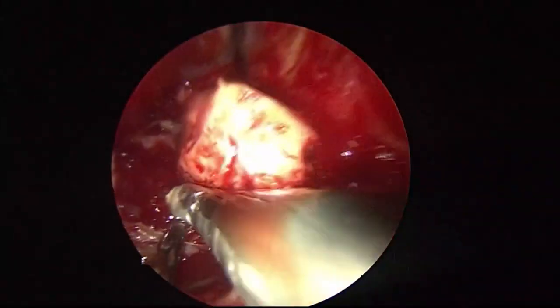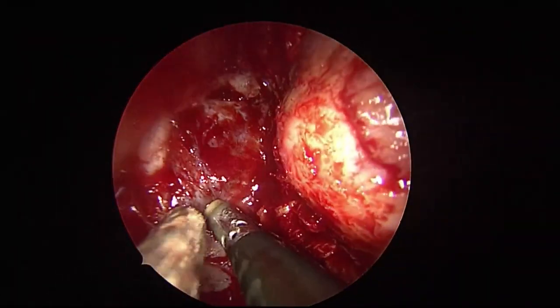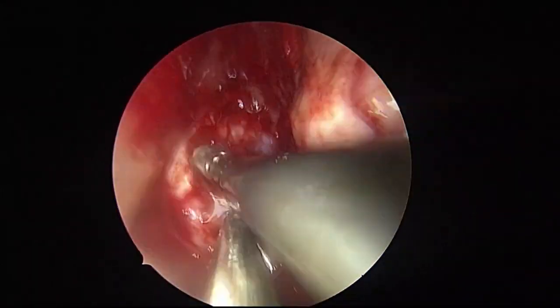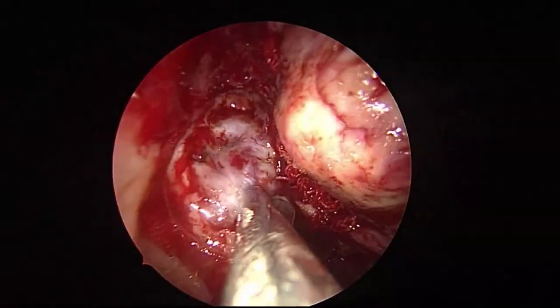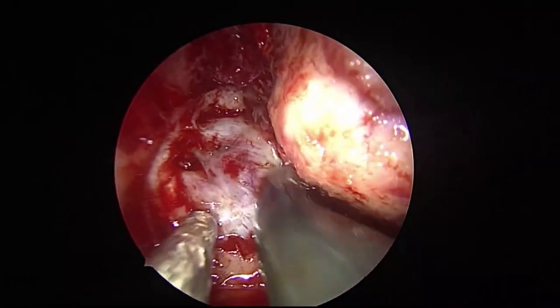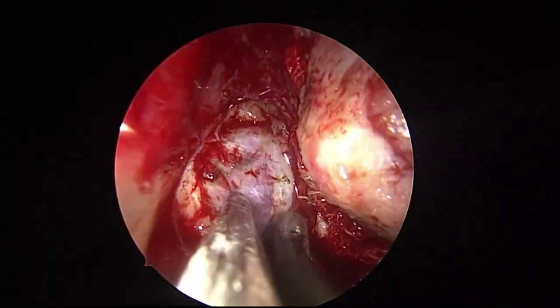See, what you are saying is a periosteal vessel. Can you see this? Yes, sir. I can run my coblator on such periosteal vessels. See this? Light coblation. So you're using the coblation? Yes. Coagulation, not cutting. Okay, and it is not head-on.